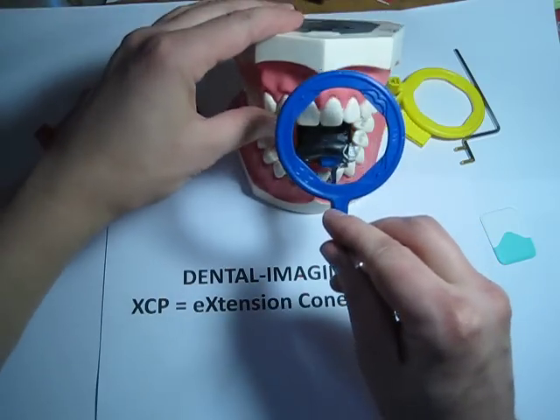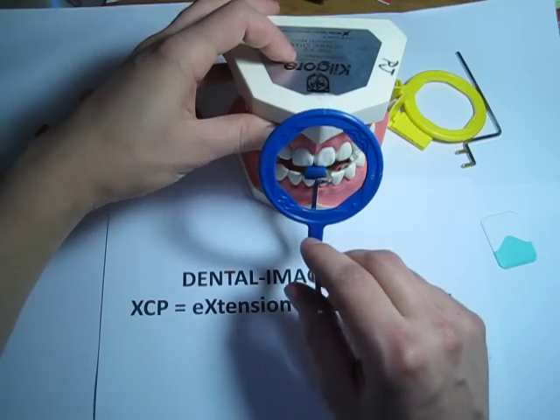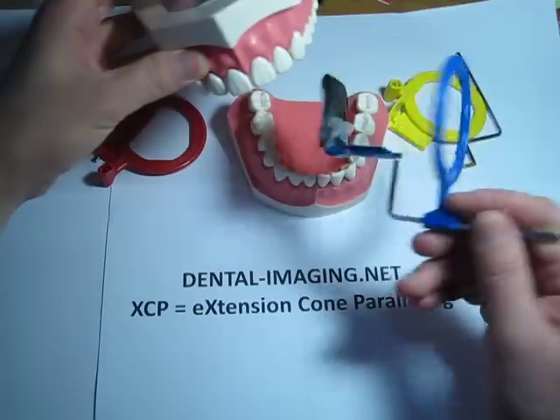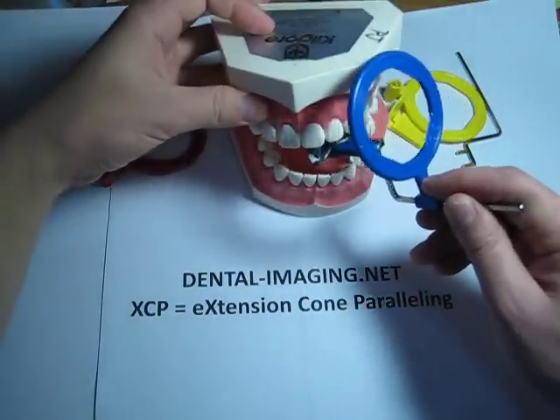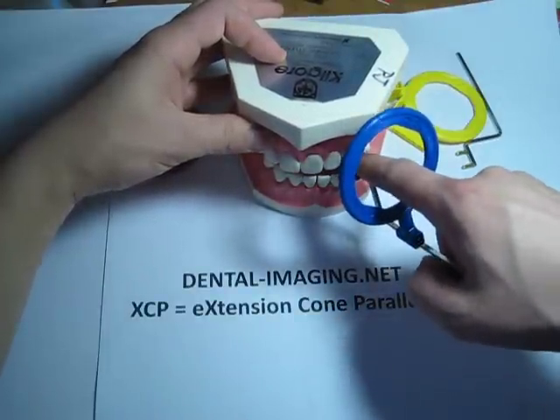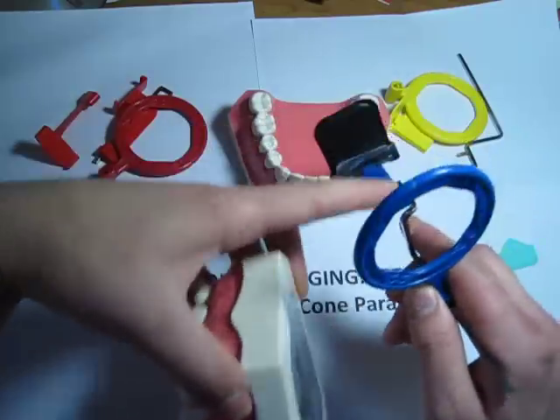For the anterior teeth, you would put this in like this and expose the x-ray this way. Then change out the film or sensor, get a new one, and do the canine here. Center it on the canine, with the canine tooth biting right in the middle of that bite block area.